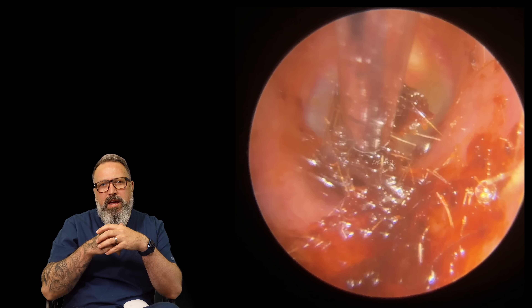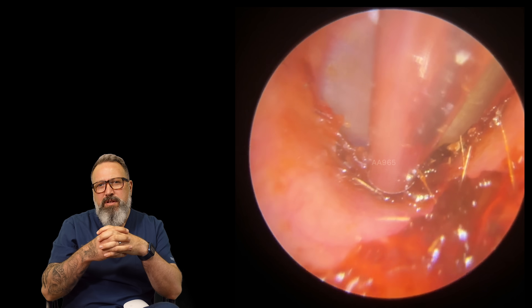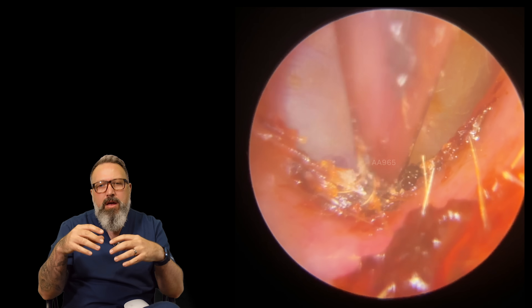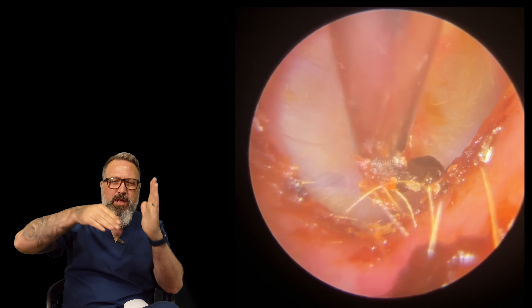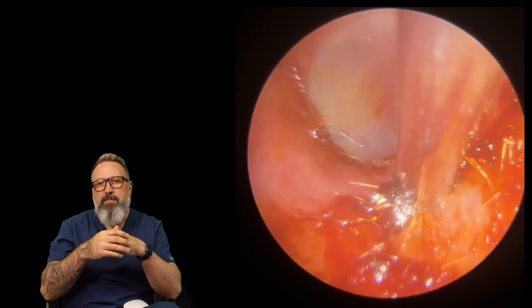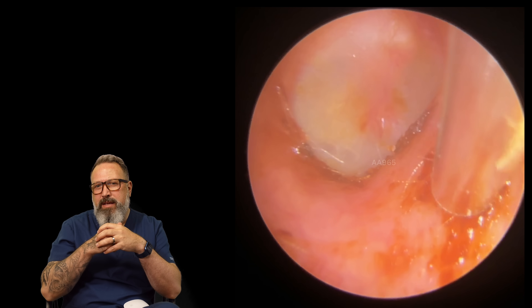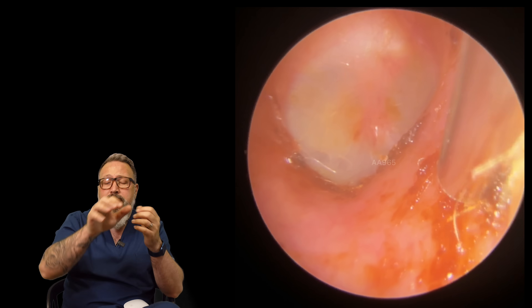Getting this deeper section away - look how almost crumbly or crusty this has become on the canal wall. This is the inferior recess. When we talk about recesses - anterior and inferior - as the ear canal reaches the eardrum you get a rise and fall to the canal wall, creating a little valley. Towards the front of the head is your anterior recess; right at the bottom is the inferior recess.